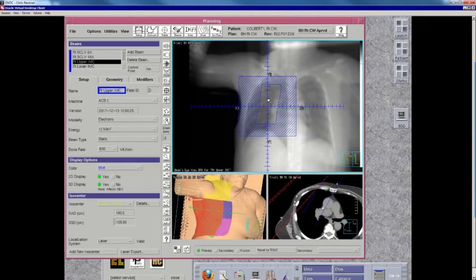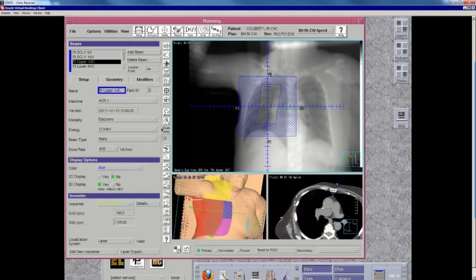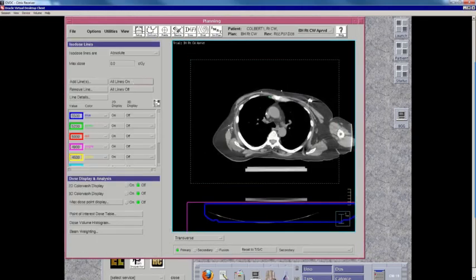I can't turn on the IMC contour in 3D right now, but let me tell you, it's pretty much right in the middle of this field, which is great. My hinge angle is 15 degrees. We use 15 when we're treating a chest wall, 10 when we're treating an intact breast. So this is a great beam configuration that looks really nice. We're going to turn these beams off into 2D. We're going to go to the axial slices, and we're going to turn the targets on, the isodose lines on, maybe.